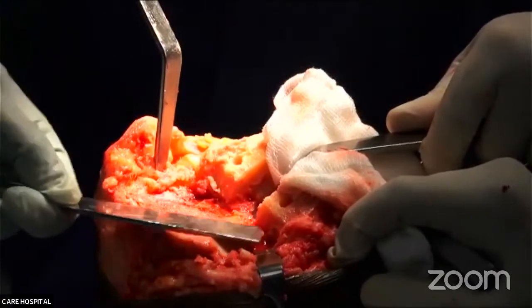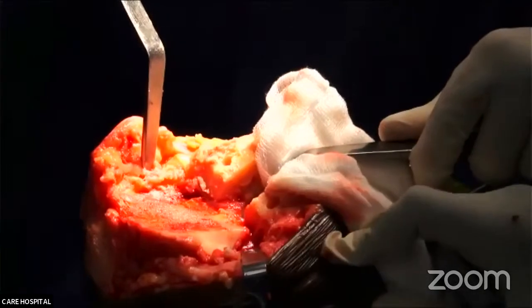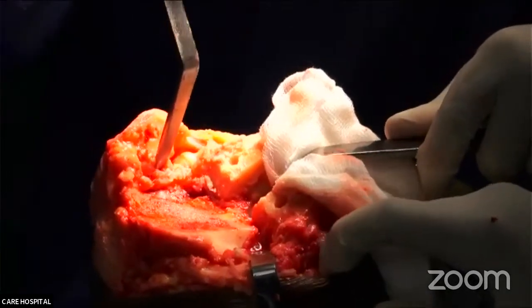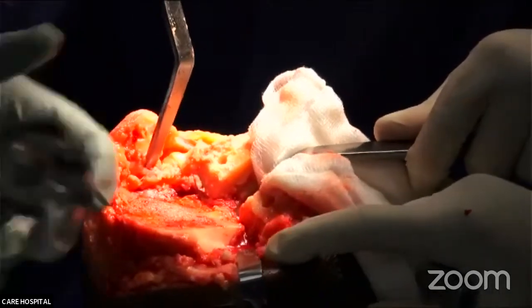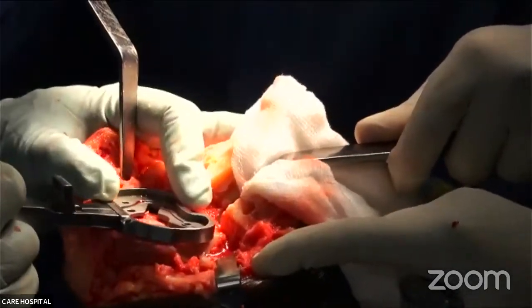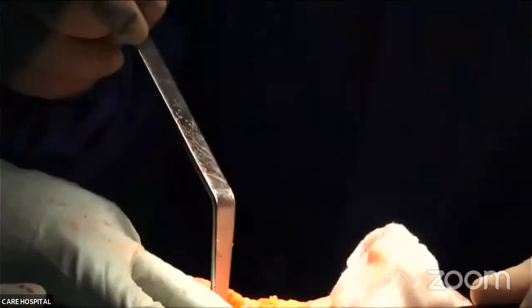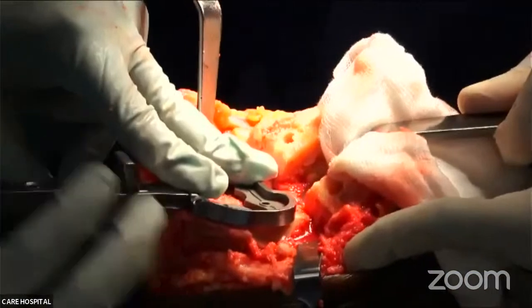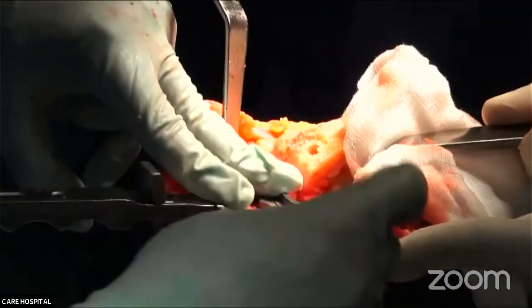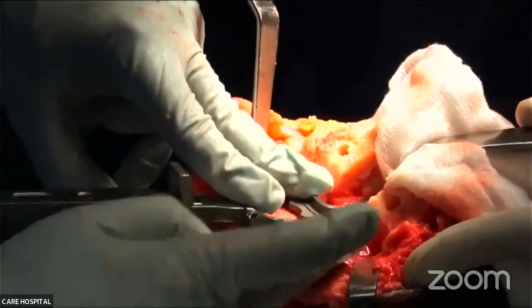Yes, yes. What you are planning for that? So we'll just see how the tibial base plate is covering, how the bone is covering the base plate, and then we'll decide. So I have got 90% coverage of the bone. Yeah. 10% is left. I'm going to put 2 or 3 screws here and then fill that with defect.